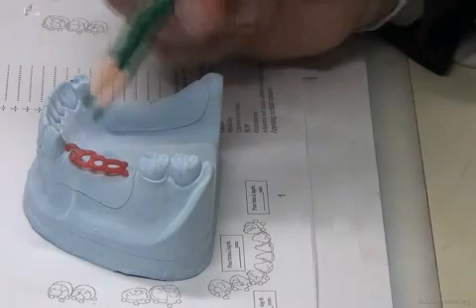Okay? What are the things that need us to move from the open lattice? The major indication to move to a mesh, for example, is occlusal clearance. An open lattice is thick. So if I'm going to place an open lattice here, I could do that. But the problem is it has some inherent thickness in it. Can I place a tooth over it and take good occlusion? This is my question.